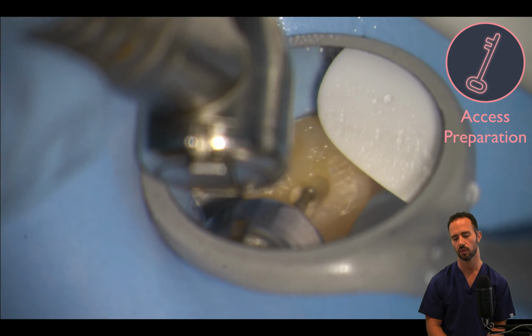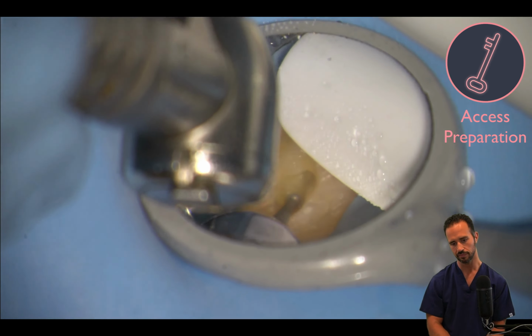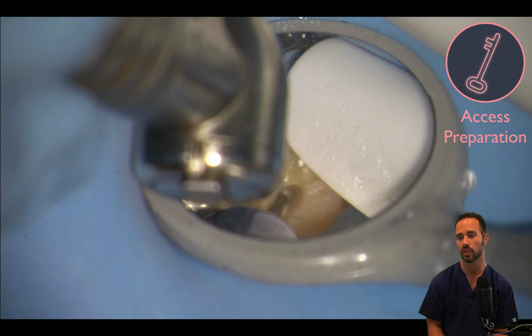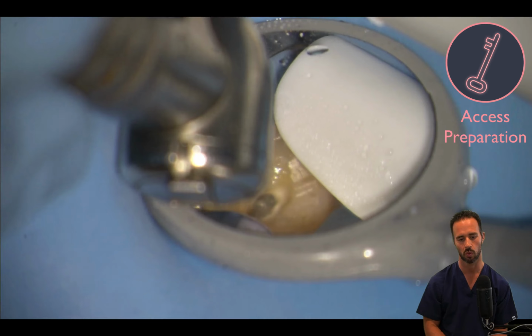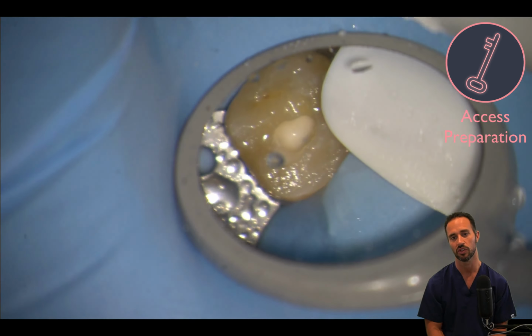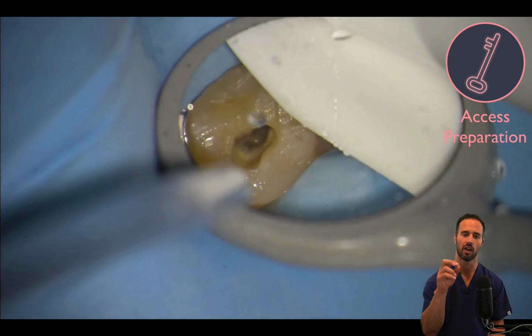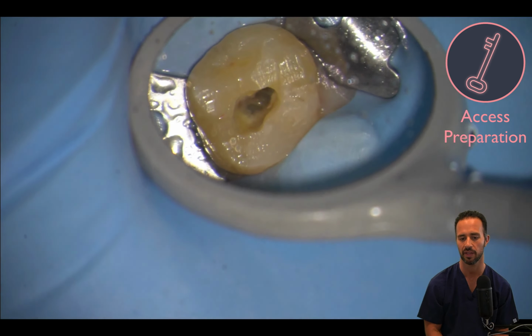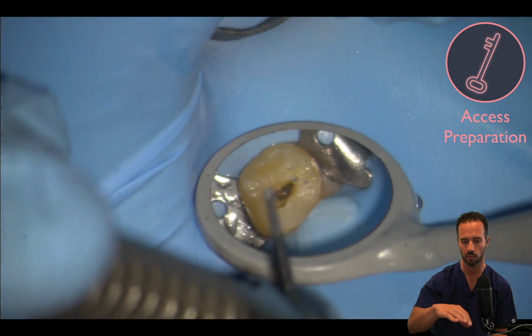And in just a second here, we're actually going to drop right into the pulp chamber. So little by little, you will drop into the pulp chamber. Remember, we saw a nice open pulp chamber on our preoperative radiographs, so we're confident that we're going to have that little drop like we like to feel when we do our endodontic procedures. So there you go. We can already see that we're in the pulp chamber there. There's more refinement that needs to happen internally, but we know we're at least in the pulp chamber. We're going to just do some more refinement.